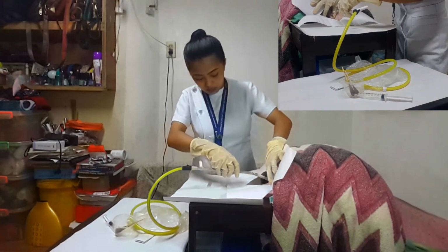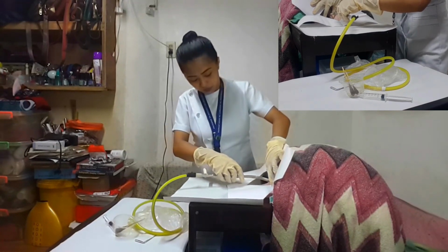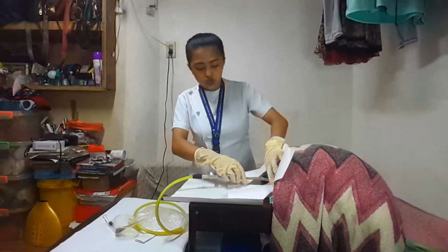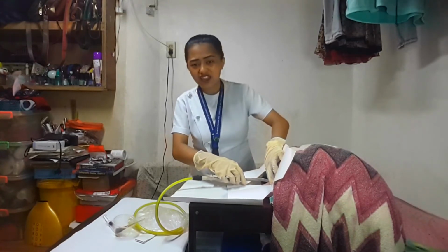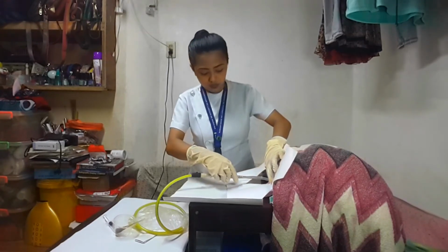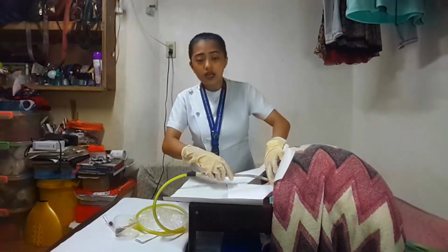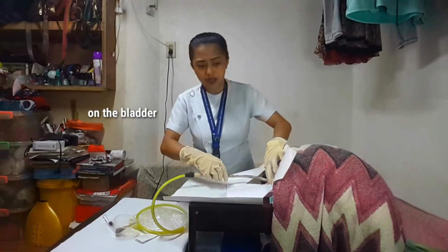Alright, until there is a urine flow. Okay, so let's observe if there is a urine flow. Alright, so once the urine drains, let us advance the catheter for 5 centimeters, or approximately 2 inches. The rationale for doing that is for not putting extra pressure on the bladder.